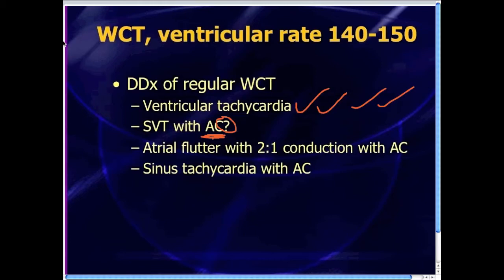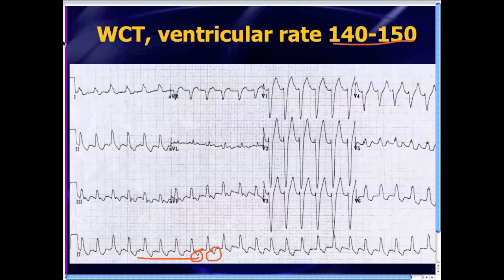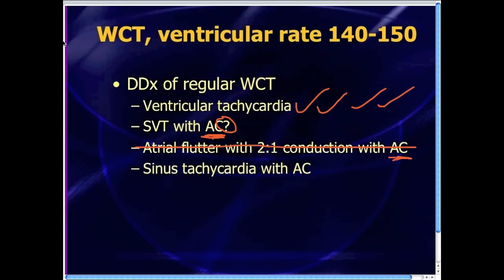Atrial flutter with 2-to-1 conduction can produce a regular tachycardia, and if that atrial flutter has aberrant conduction, that'll give you a regular wide-complex tachycardia. Looking back at this 12-lead, is there any evidence of atrial flutter? Do you see flutter waves mapping out at a rate of about 300 beats per minute? It kind of looks like there's a little sawtooth going on, but those complexes map out to a rate of about 140 to 150 — too slow to be atrial flutter. So we can probably rule out atrial flutter with 2-to-1 conduction, and we're really doubting SVT with aberrant conduction as well.